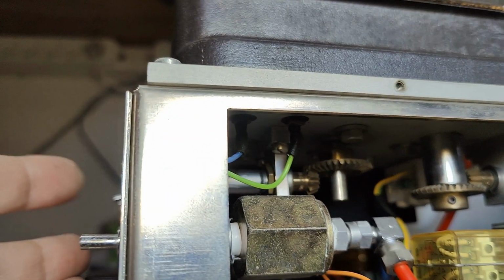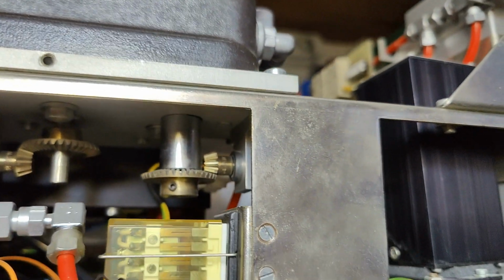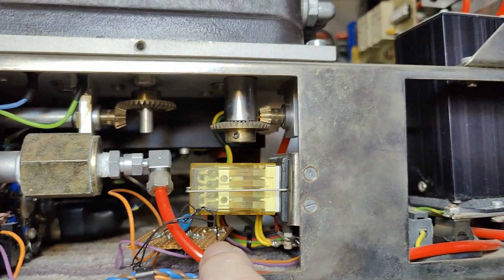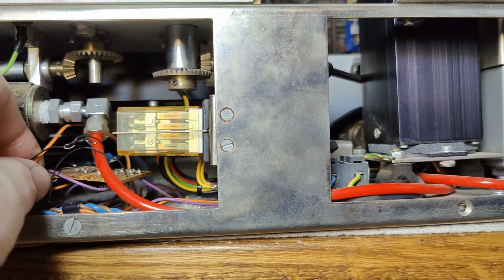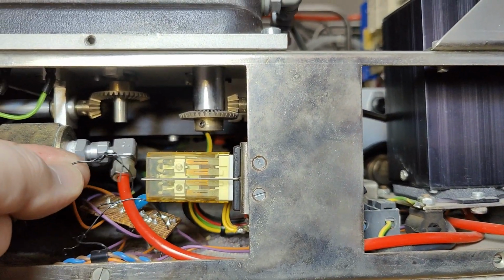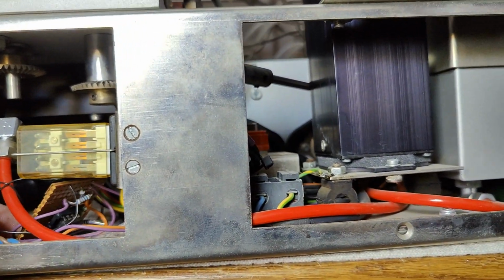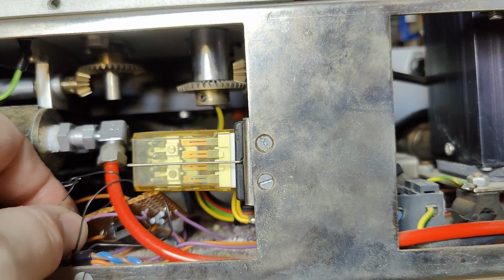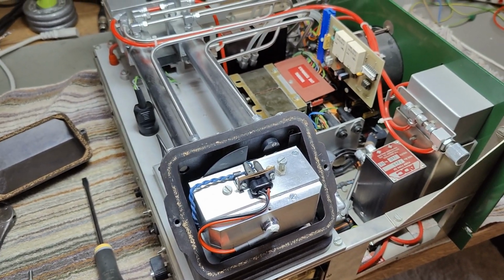there's a little adjuster here from the back that goes to that point where you can adjust some stuff. And this was the front panel adjustment, and there's a little circuit. Ooh, how nasty. A little circuit board, see? This is how it's mounted. How nice. So, aha, a little op amp. Oh, that goes to that quarks. I think we are inside the detector unit.